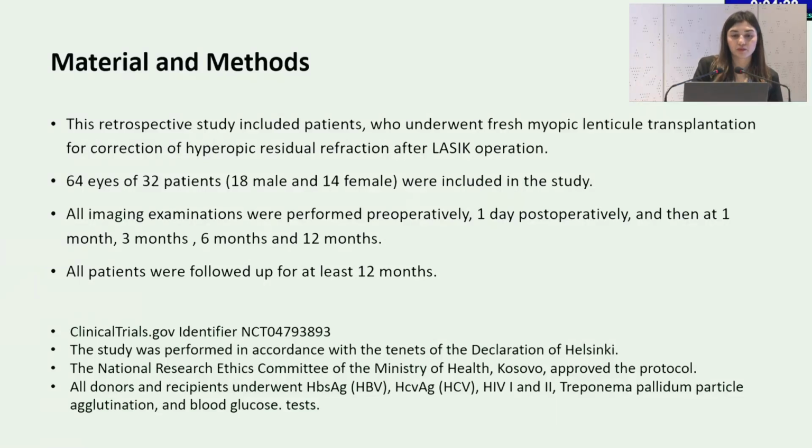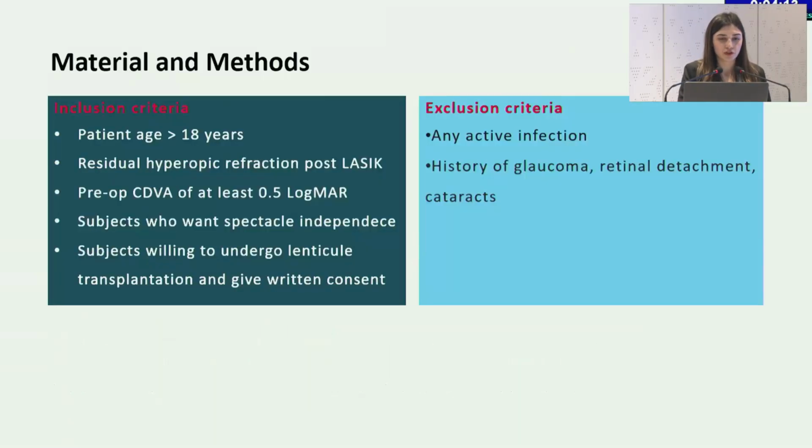In this retrospective study, we included 64 eyes of 32 patients, 18 male and 14 female, and all patients were followed for at least 1 year. The study was approved by the National Research Ethics Committee of the Ministry of Health of Kosovo. Our inclusion criteria were that patients were at least 18 years old and had already undergone LASIK surgery and had residual hyperopic refraction.